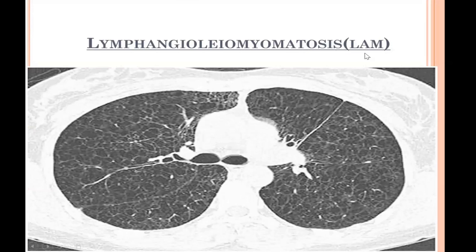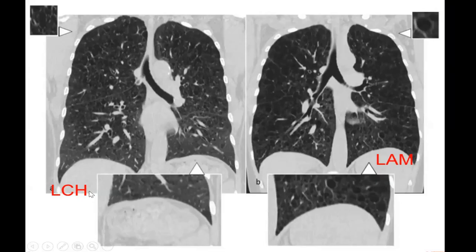Lymphangioleiomyomatosis is a condition commonly seen in females and in patients with tuberous sclerosis, producing multiple thin-walled cystic spaces distributed throughout the lung parenchyma including the lung bases and costophrenic angles. Comparing Langerhans cell histiocytosis and LAM: LCH shows irregular, bizarre-shaped cysts in the upper and middle lobes with sparing of basal segments and costophrenic angles, while LAM shows smooth-walled cysts distributed throughout the lung parenchyma including the costophrenic angles.